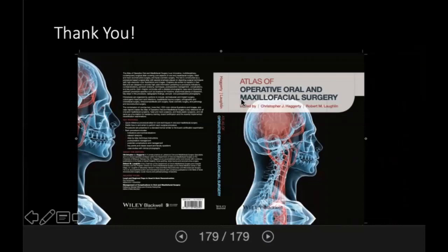Okay, so there's another question here. It says, regarding Dr. Chen's question, would the healing abutment's presence benefit the implant's integration with progressive loading of those implants? I don't think so. That's a great question. And yes, of course, that is kind of how the whole process works: the implants are stimulated, and they exert a dynamic pressure on the bone. That dynamic pressure preserves the bone. That's why if you don't have any load on the alveolar process, you do get disuse atrophy. But because we're only allowing the implants to heal for 6 to 8 weeks prior to receiving their locator attachments, probably not.